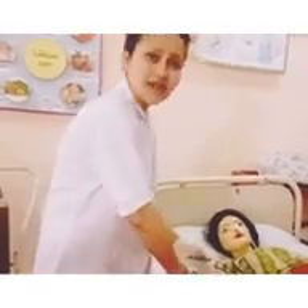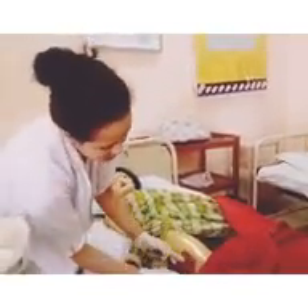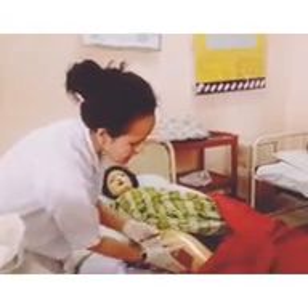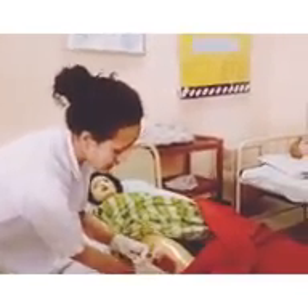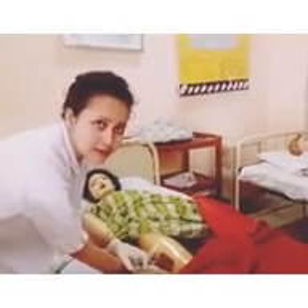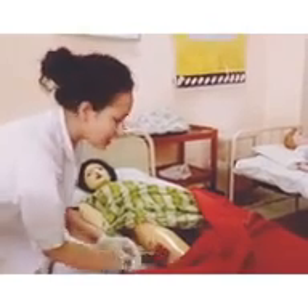The next site is the vastus lateralis, which is on the anterolateral aspect of the thighs, that is the upper thigh. We place our fingers out here and then rub first with the cotton swab to clean the area, then provide the injection. We put the thumb and index finger here, with the thumb on the piston, and slowly release the medicine. But remember, before you release the medicine, you have to first withdraw slightly to check whether there is any blood coming out or not. If blood is coming, you withdraw the needle. If blood is not coming, then you can provide the injection.